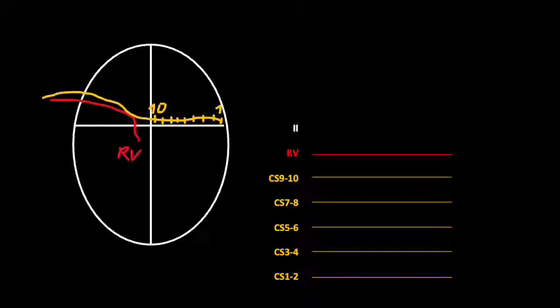So when we've got the accessory pathway, it's a parahisian, so it should be close to the bundle of His. Again, we perform the same maneuver as before. So now let's start pacing with the lower voltage. QRS complexes are quite wide, and then we perform the pacing with higher voltage, so QRS complexes should be much narrower.